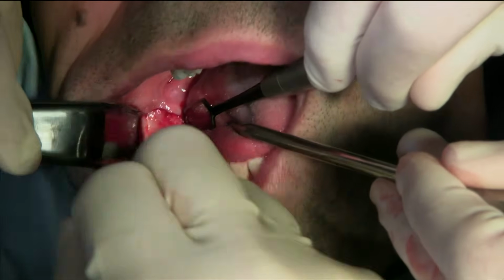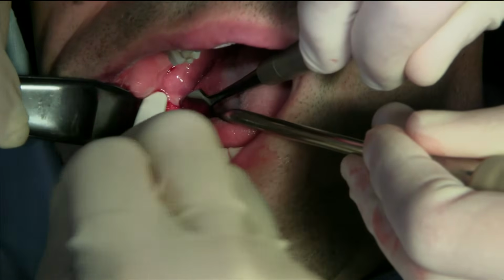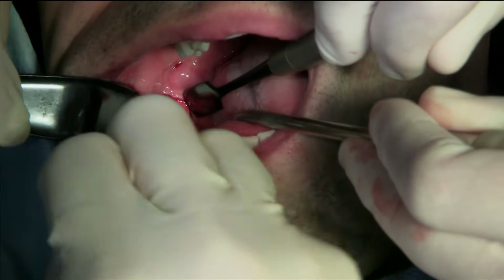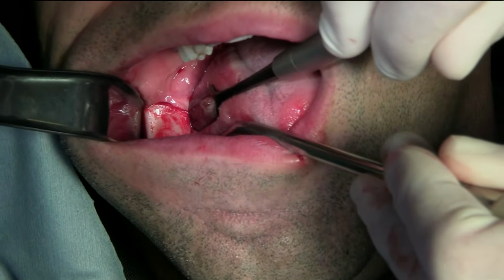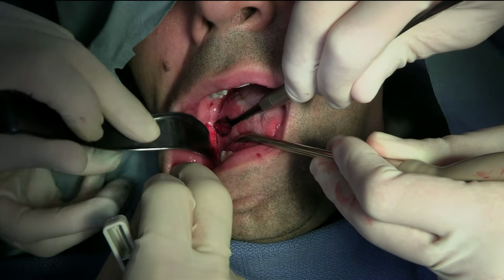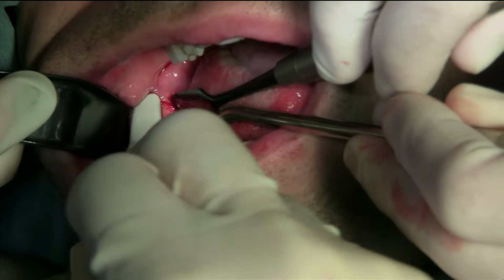Just a lot of pressure. Can you hold this one here? Hold this one here. Close a little bit. Close a little bit. Yeah.